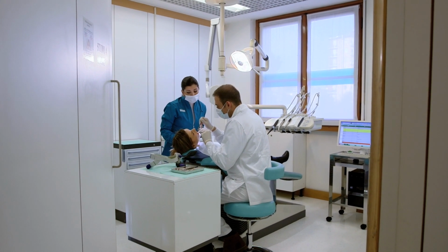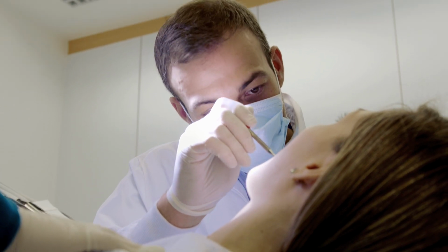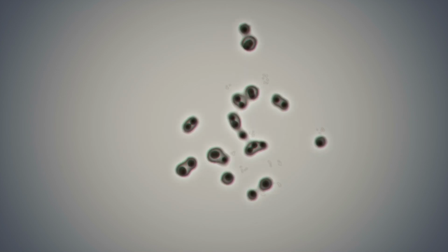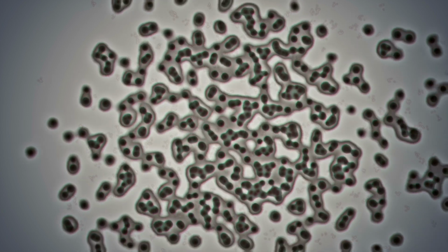Bacteria in dental unit waterlines is a serious problem. If your dental water does not meet the American Dental Association guidelines and the Centers for Disease Control recommendations for infection prevention and control, your patients are at risk. If left unaddressed, colonizing bacteria can grow to be biofilm and can result in unsafe and odor-producing water.